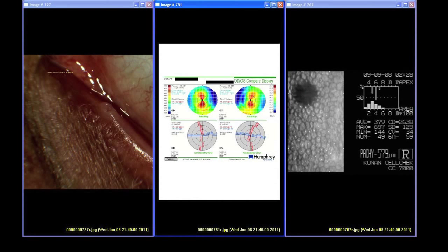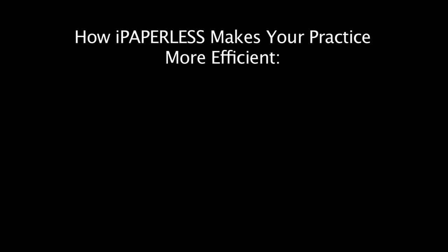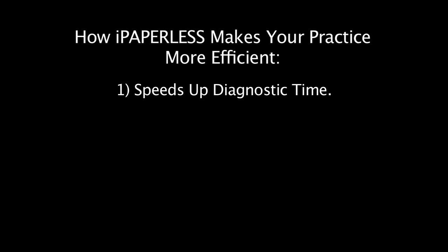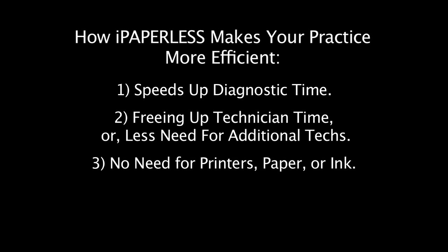Now data from all instruments can be displayed together for better diagnostic evaluation. Here you can see we have grouped all anterior instrument data together and posterior data together. By being able to view data in this way, iPaperless makes your practice more efficient by speeding up diagnostic time, freeing up technician time, and eliminating the need for printer, paper, or ink.